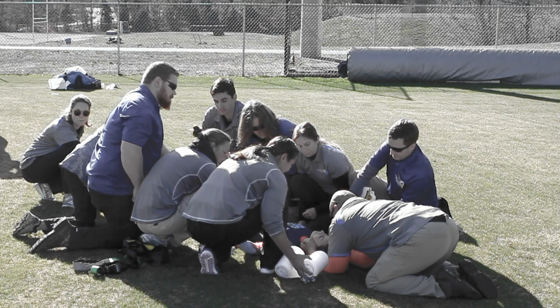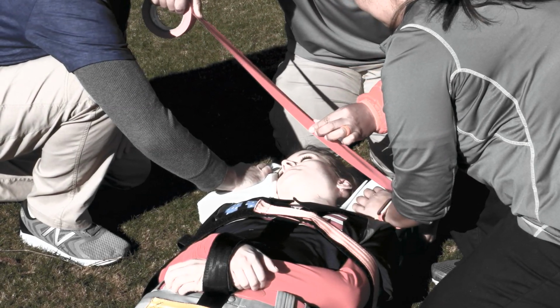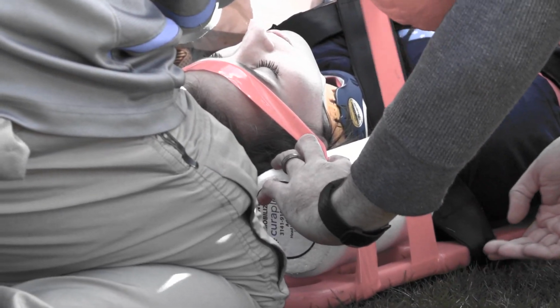When the athlete goes down, remember clearance and permission may be needed to access the field of play from officials. In some sports, the action continues. Once the athlete confirms central neck pain or significant neck pain, the initial plan should be collar and board. Further exam and evaluation may be warranted, but one is never at fault for being cautious.